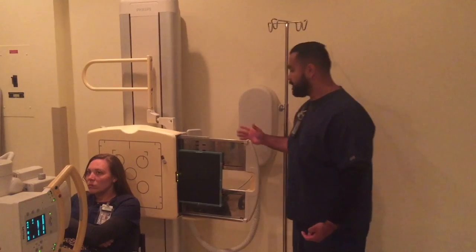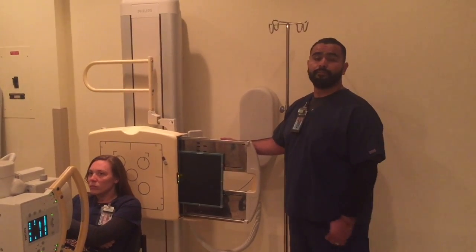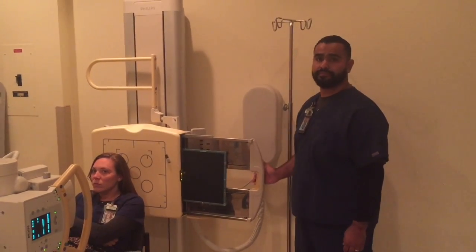I have my 10x12 IR. It is in a lengthwise orientation. My technique today will be 85 kVp at 28 to 32 mAs.